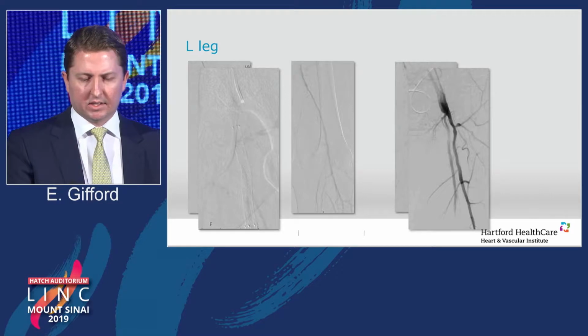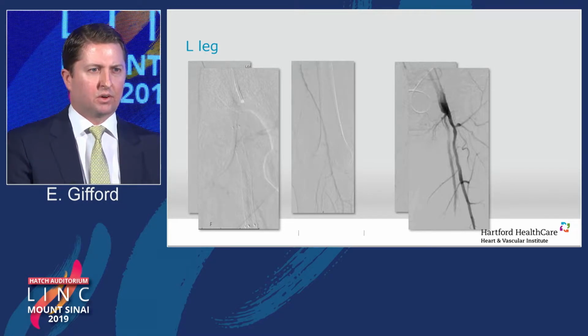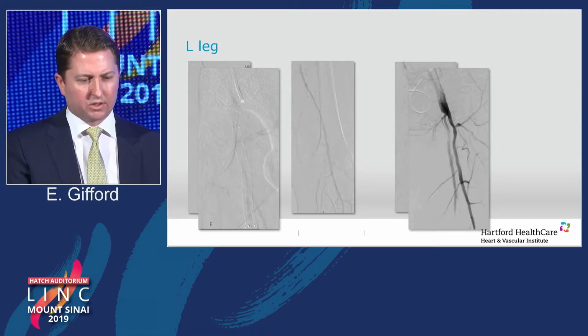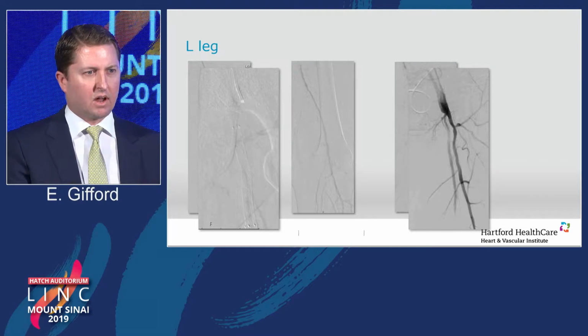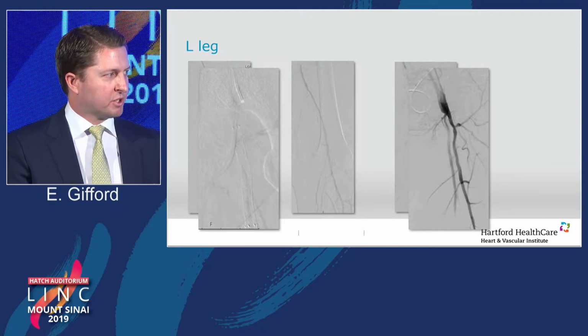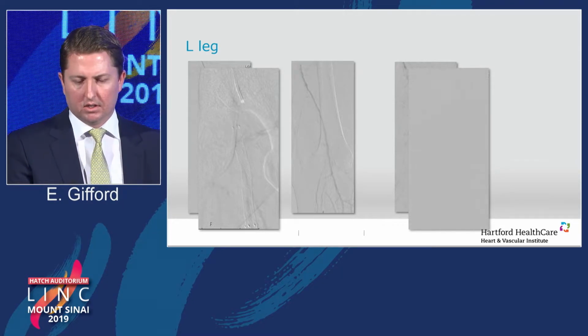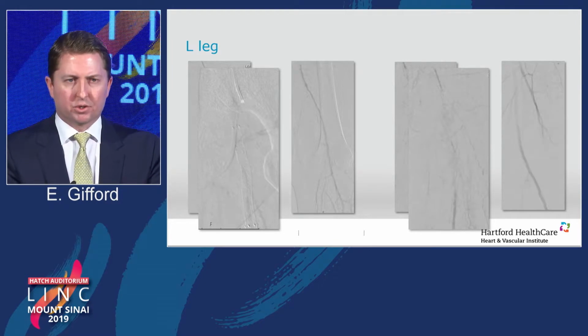And we hit this again with a balloon, but given the fact that we did not use a directional atherectomy catheter in the presence of the bare stents, the question is whether or not anything else could have been done in this particular scenario. I think looking over what we've talked about in the conference here, one of the things would be utilization of IVUS to try to visualize how much stenosis is actually left at this area. And then if you look now at her runoff, you can see nice brisk runoff now with preferential filling of her normal anatomy through the SFA.